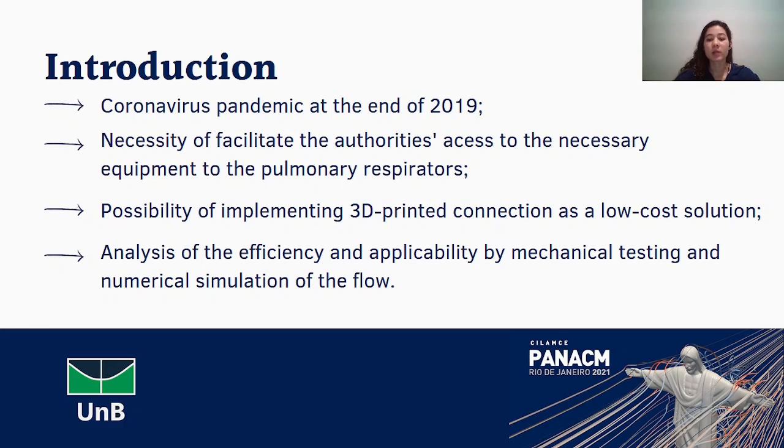The context that generated this theme was the coronavirus pandemic at the end of 2019, where due to this disease, the most severe cases need to be intubated, and as there was a high demand worldwide, we came across the necessity of facilitating the authorities' access to the necessary equipment for the pulmonary respirators. One way that was found was the possibility of implementing 3D printed connections as a low-cost solution.